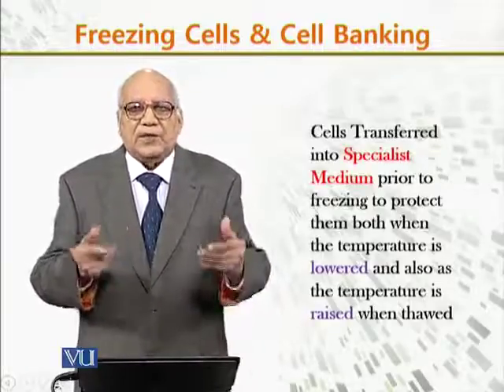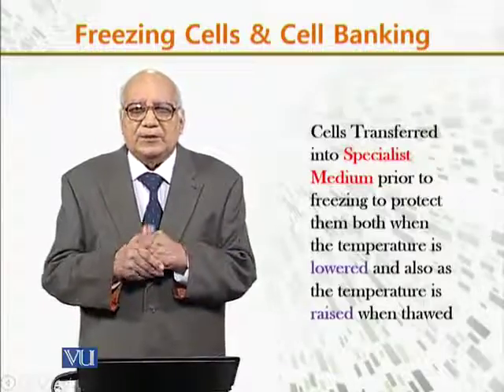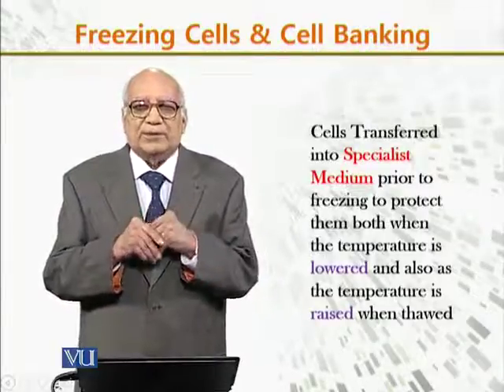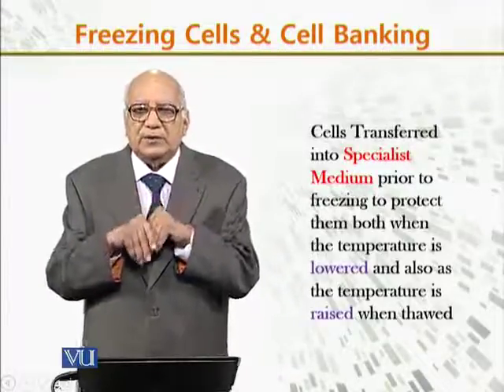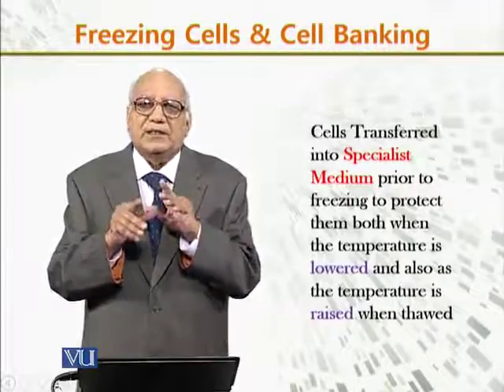Now, the cells are transferred into a specialized medium prior to freezing, to protect them both when the temperature is lowered and also when the temperature is raised, that is, when it is thawed.